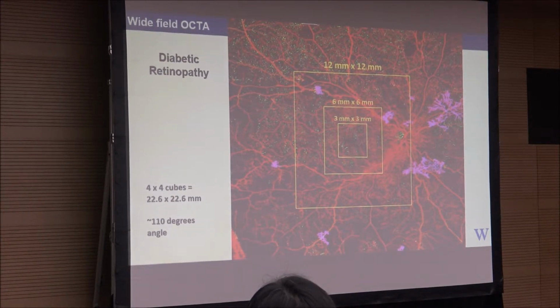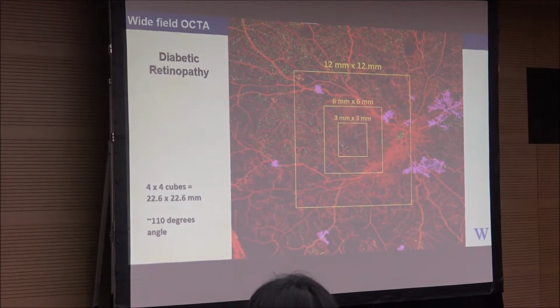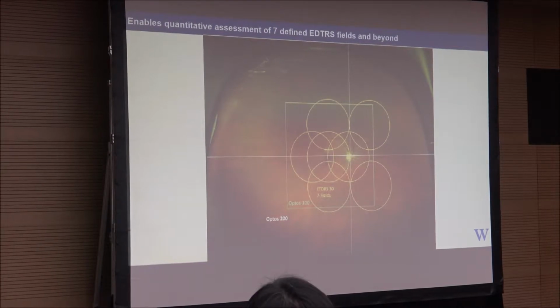Because you have about 110 degrees field of view, this gives you an opportunity to quantify the 7 defined ETDRS field of view assessment.